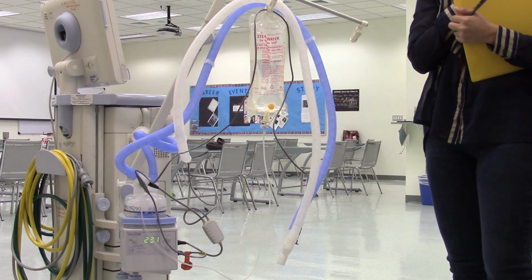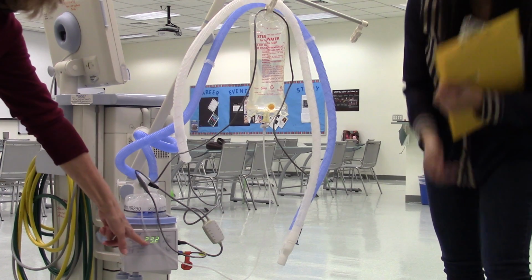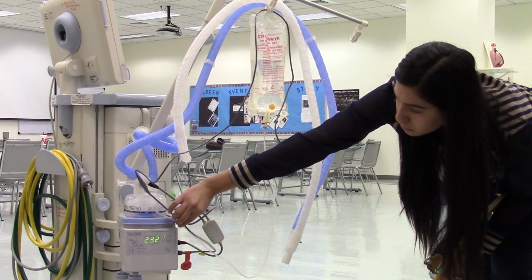It says locate the digital readout where the water temperature is displayed. And right now, you see the water temperature is 23 degrees.